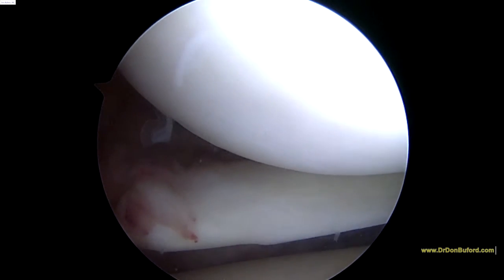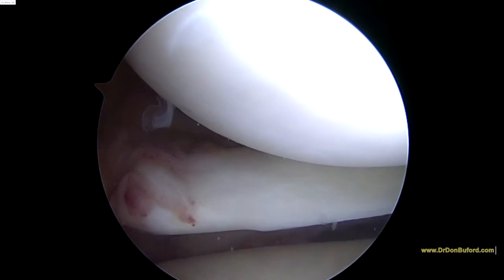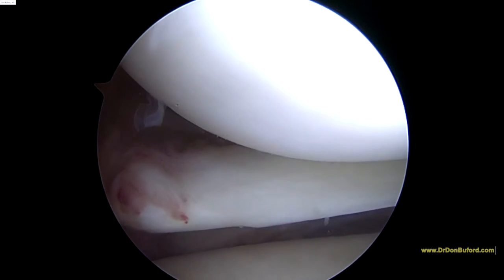What we're going to do is inject into the capsule, and because this is into the capsule, I don't think we need to turn the water off. When we get to the meniscus and some other areas, we will.